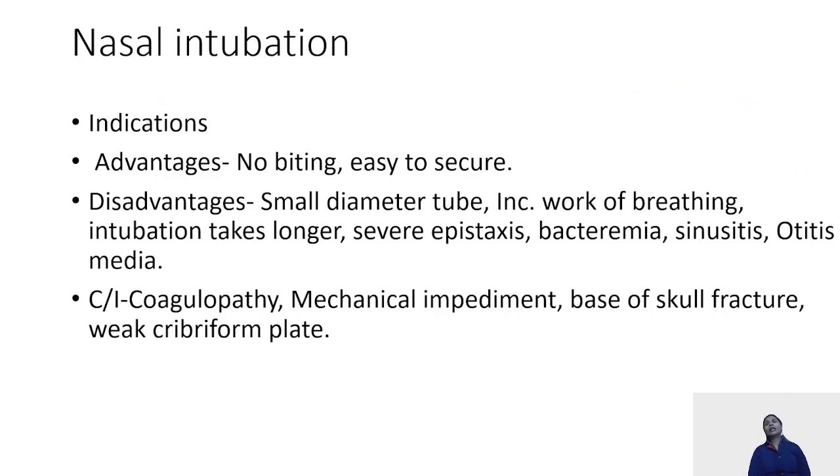Nasal intubation. See, the indication for nasal intubation is if there is any problem in the oral cavity, like you have an oromaxillofacial surgery, you cannot intubate the patient orally. Done. Then if there is any mass in it or you have trismus, restricted mouth opening. In all these cases, you prefer a nasal intubation. The advantage of nasal intubation is that the patient is not going to bite the tube. It is easier to secure and it is better tolerated than oral intubation.